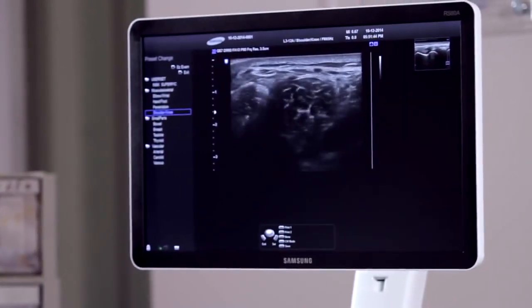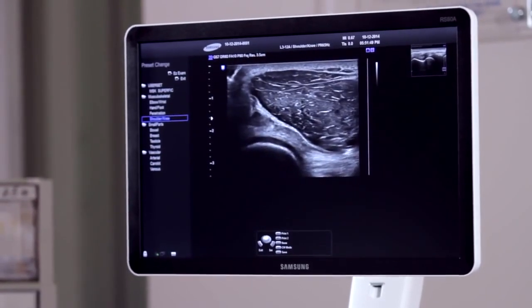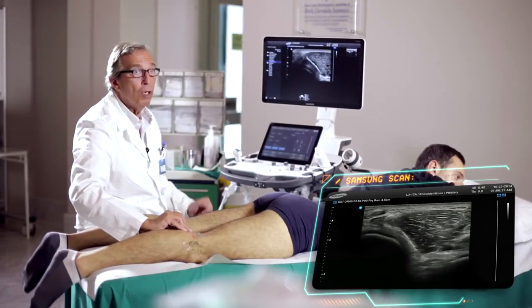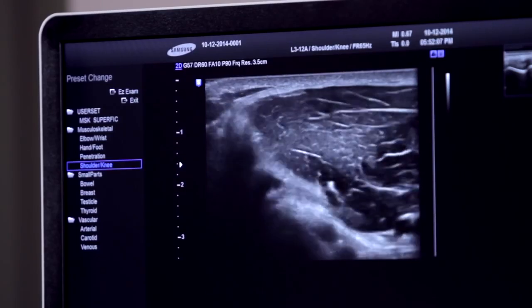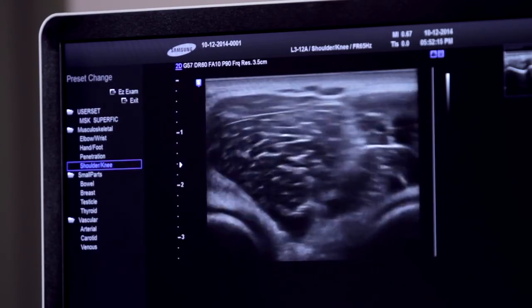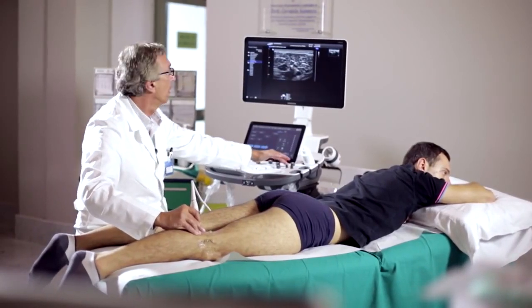Specifically, in this medial posterior region, we recognize the components of the gastrocnemius muscle and the semimembranosus muscle, which are contiguous and, as we know, are separated by the common bursa of the gastrocnemius semimembranosus. This bursa, obviously, in this case, is not visible as it is collapsed and not filled with liquid. Very often, however, it is highlighted in the form of an anechoic bursa if, for example, there is a joint effusion. Another structure we encounter moving the probe towards the center is represented by the vascular nervous bundle.